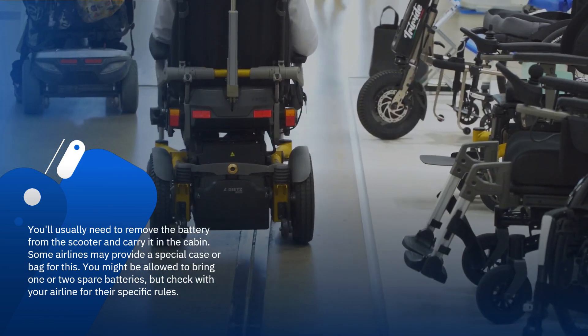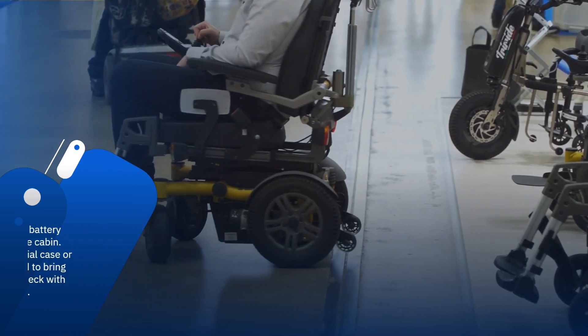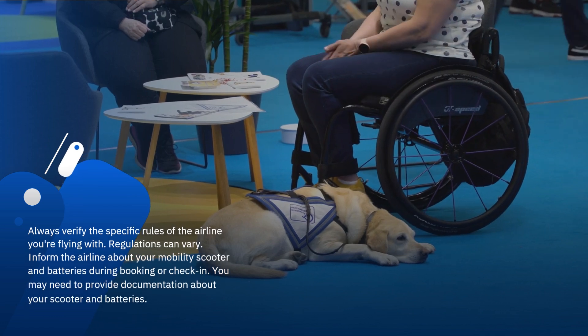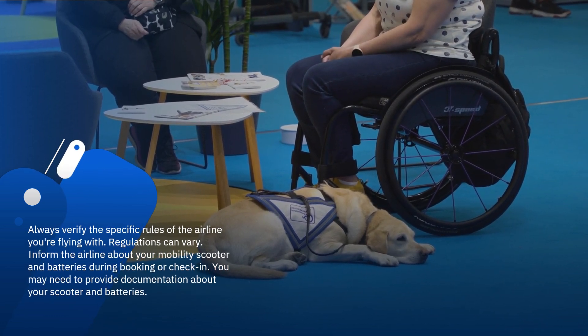You might be allowed to bring one or two spare batteries, but check with your airline for their specific rules. Always verify the specific rules of the airline you're flying with, as regulations can vary.